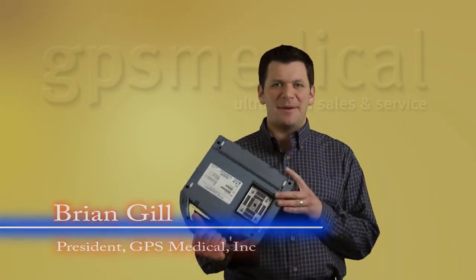Hi, I'm Brian Gill from GPS Medical, and today we're going to discuss the Sonosite M-Turbo ultrasound.